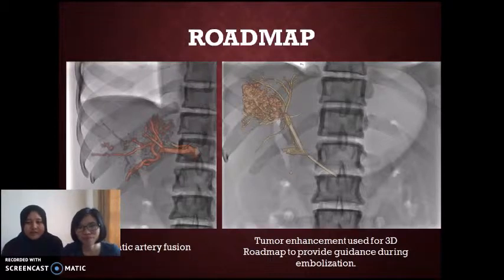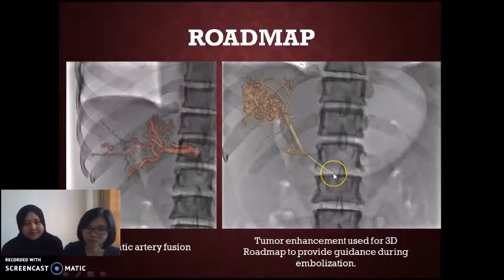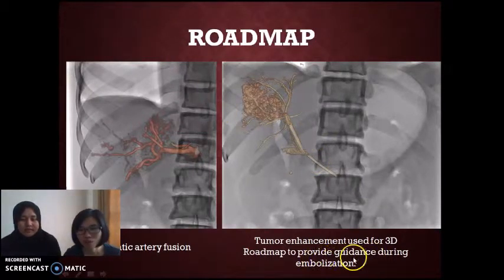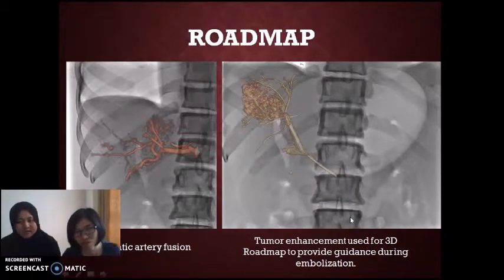Same with this image, but this is the treatment for the tumor. It also uses the same technique, and it's easier for the doctor to treat the patient because of the roadmap, because it provides proper guidance during the embolization. So it's quite easier for the physicians to do the treatments and the procedure.